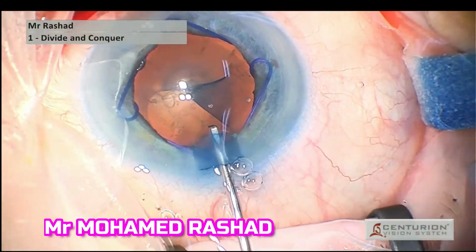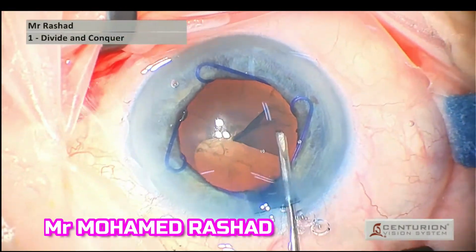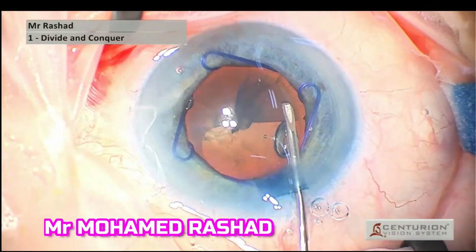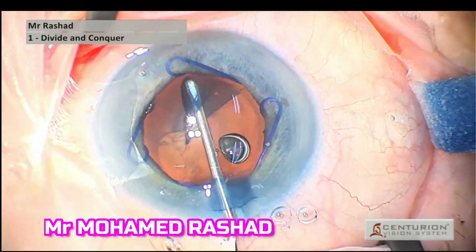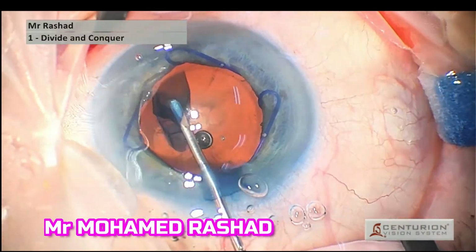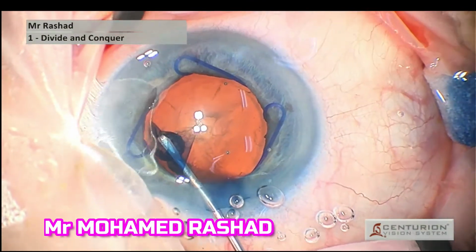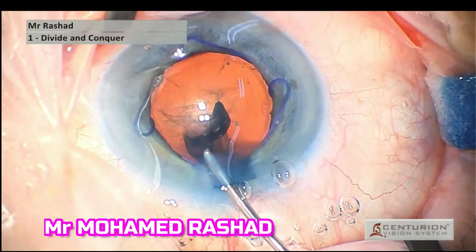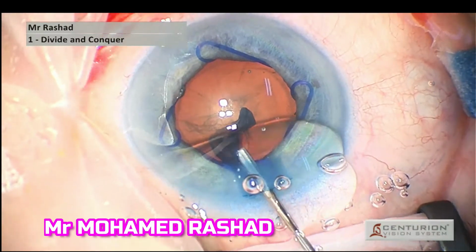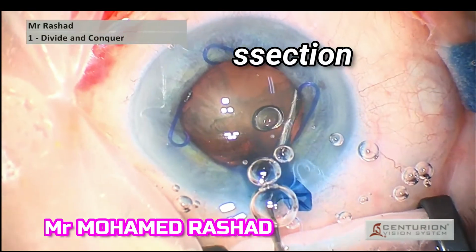if you feel that the AC is shallowing. And every 3 clock hours I usually inject a little bit of cohesive OVD as shown here, and I usually use the shearing forces of the capsule. Then we finish the capsulorhexis. With the hydrodissection I make sure that all the OVD is outside as well.